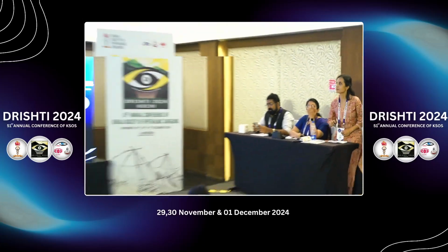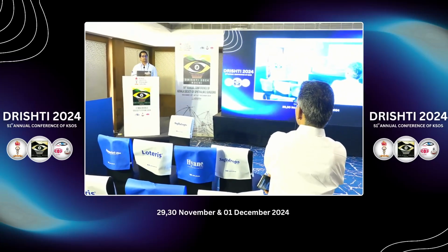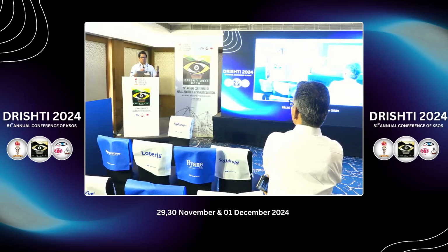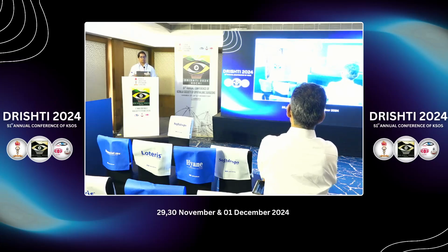Yeah. So Manoj, I don't remember the study. There was something in the long term which says that the pressure comes down by 1 millimeter if you do cataract surgery. That depends on the initial pressure, sir, the population they have studied on. In this particular study that I showed, there were patients who were hypertensive and normotensive. The normotensive patients don't have that much of a response, and the pressure reduction lasts only for about a year or two. After that, it comes down to the mean. Whereas where the starting pressures were higher, there you can expect a more dramatic reduction in the pressure.